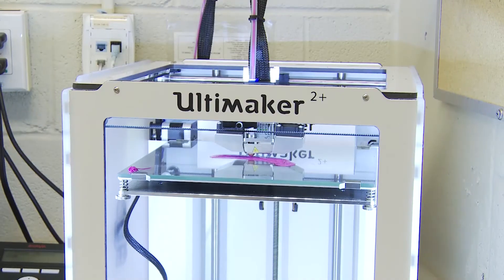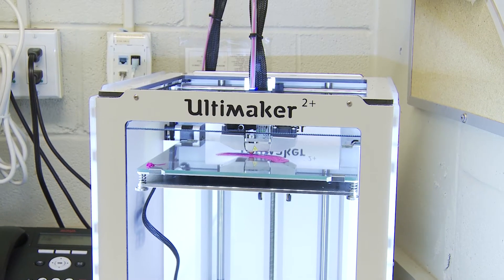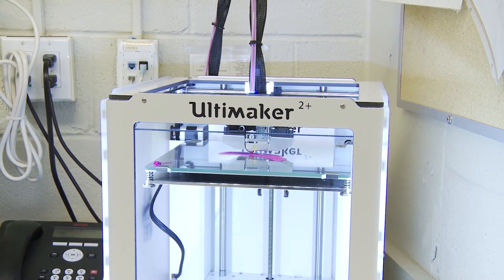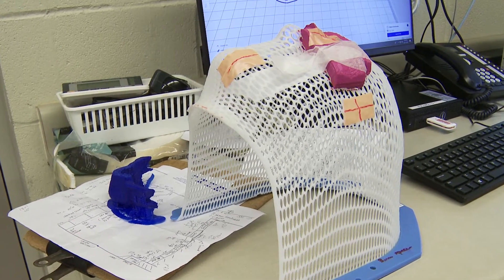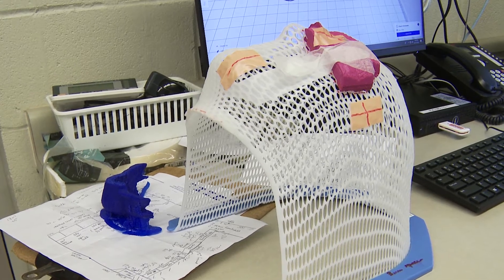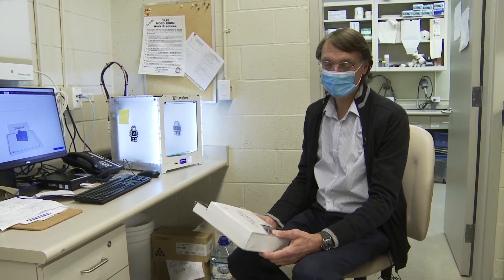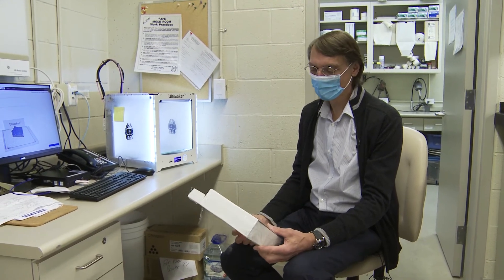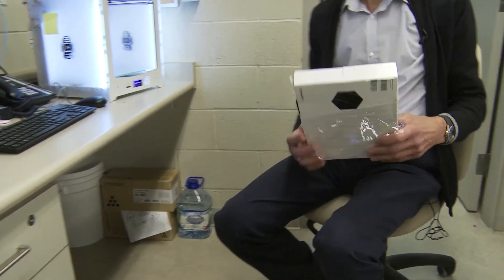Here we are in the lab where we actually print the boluses. Thanks to the foundation, we've got the Ultimaker 2 Plus 3D printer, which has proven extremely reliable. The material we use to print the boluses with is called PLA. It's made from plant-based oils, so it's extremely environmentally friendly and relatively cheap — an excellent choice for making bolus.